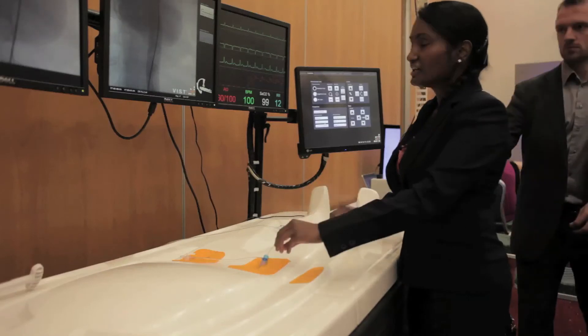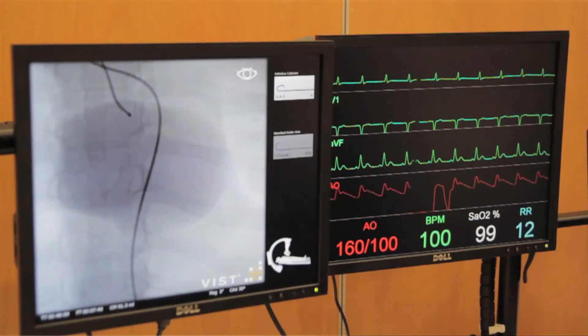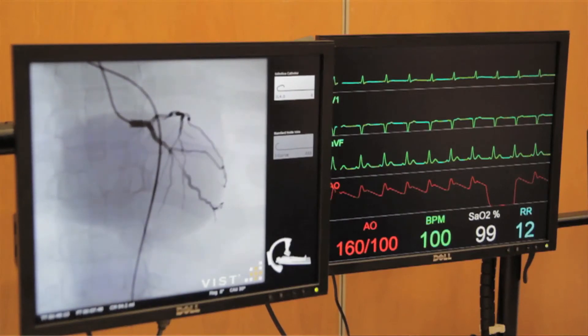And again, this is something that we encounter in daily practice. The catheter has actually slipped out of the coronary ostium. So we re-engage back again and then we acquire the image in the PA caudal view.